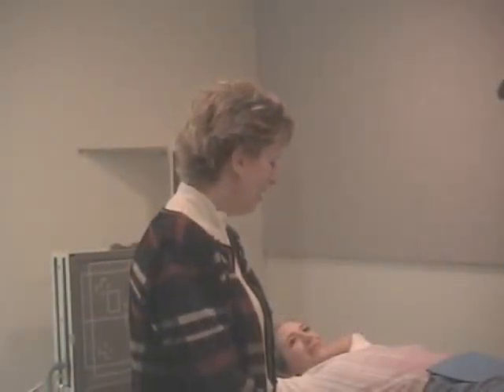Hello class. I've got Kristen on the table today, and the focus of this lesson will be a knee exam. I'm actually going to demonstrate a patella as well as the normal knee procedure consisting of an AP and a lateral. Of course, in some of your institutions, the patella might be a normal part of the protocol. You do AP, you do lateral, and you do the patella. And some places even do an oblique. But the main three that we're going to show you in this lesson are the AP, the lateral, and a patella.